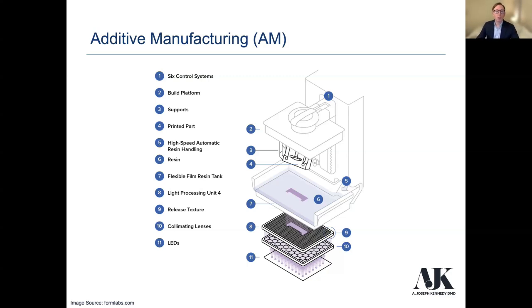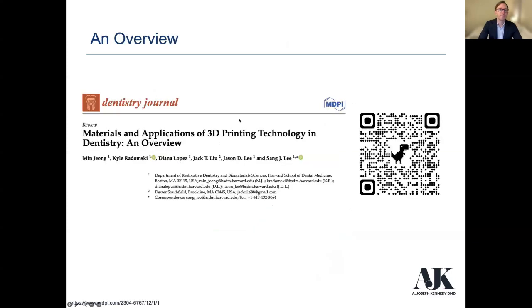The main things that we're looking at is we've got on the bottom here, in their instance, a set of LEDs. And then we've got this resin tank, and it holds resin. And then we've got a build platform at the top that just kind of dunks, and I'll show you a video on this. And then that LED flashes a picture, and it cures that resin in the resin tank. And over time, it adds up. That additive manufacturing essentially builds the restoration that we want to make.